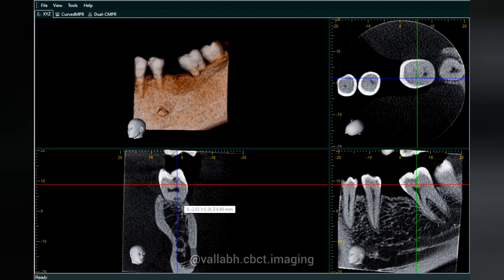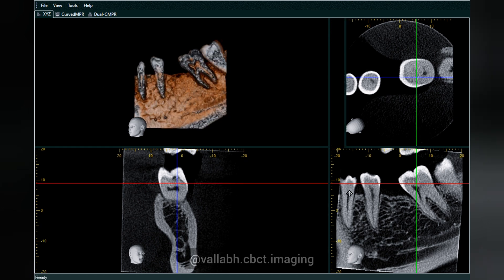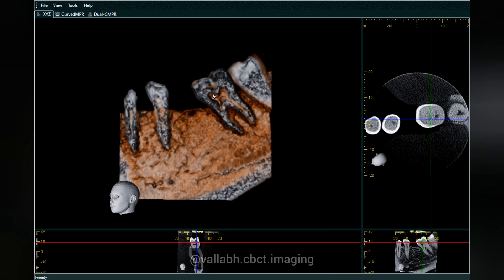We have just used a sagittal cut section. Now, this is the tooth enamel, dentine, coronal pulp, radicular pulp, and again the radicular pulp. This is the interdental bone or the furcation region, and this is the interdental bone.